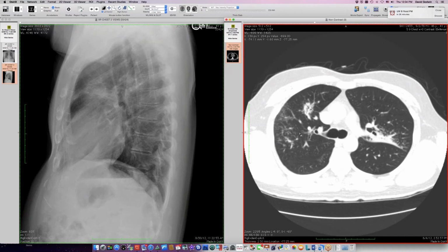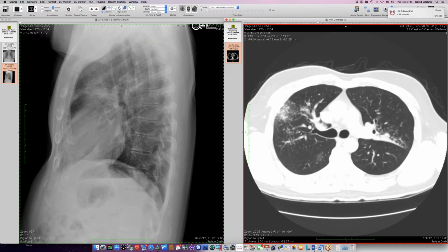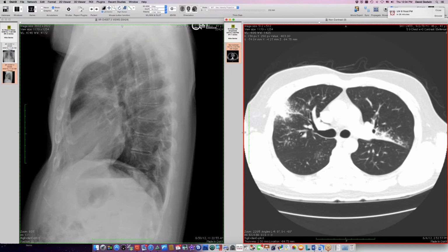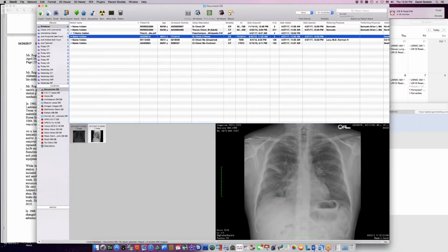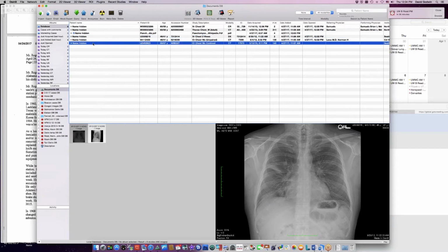So it was actually gut and lung involvement here, but it was invisible to the endoscopist. It was not visible on CT, his abdominal portion at least. I think we should also remember that it's not rare to diagnose concurrent sarcoidosis and lymphoma in the same patient at the same time. That does happen, so you always wonder if he might have both. That's a good question. It could be another case of pick'em stick'em, more than one disease. In this case, associated diseases.